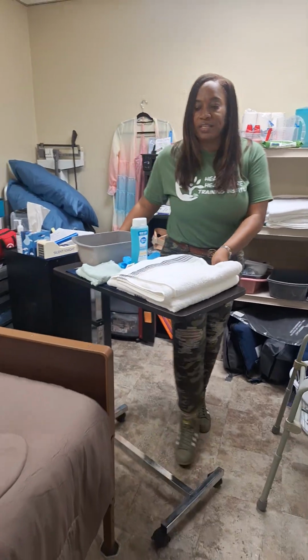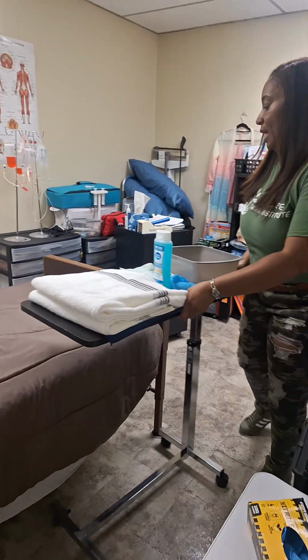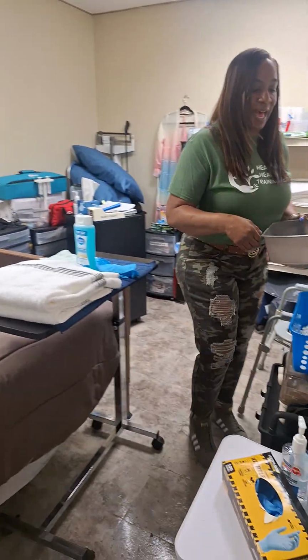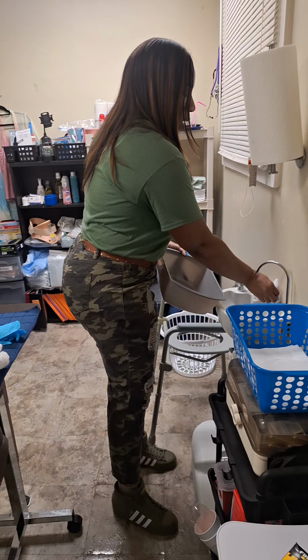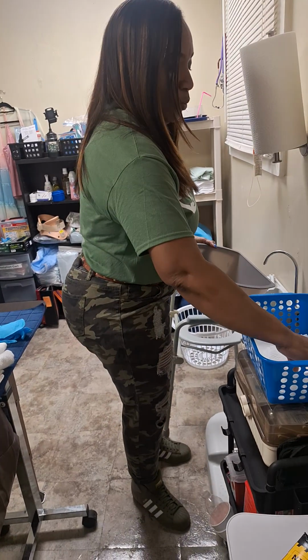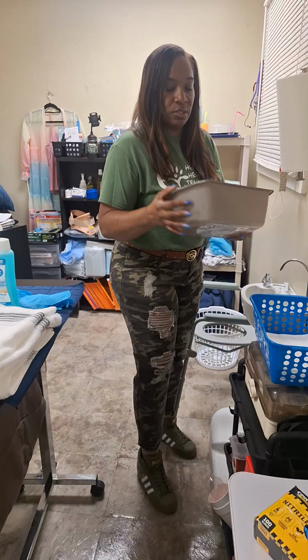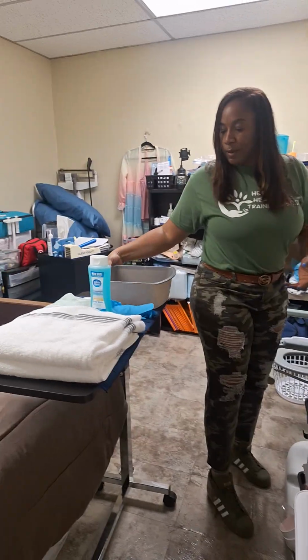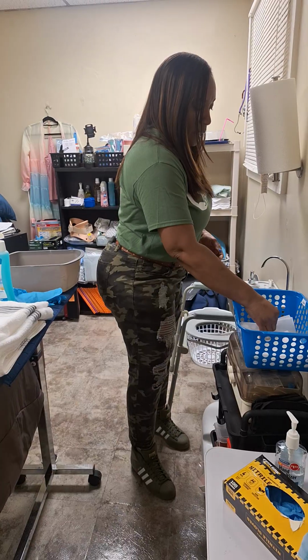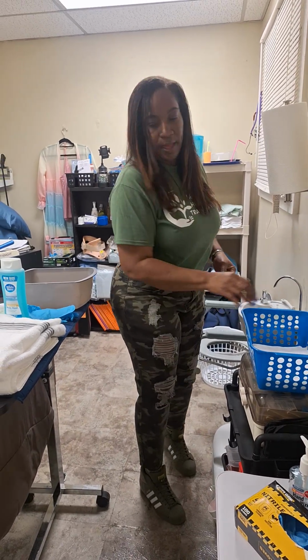So I'm going to bring this over here towards the sink. And I'm going to grab my paper towel to turn on the water. I'm going to fill my water to the 2 line. You don't need a lot of water. You just need it to be to the 2 line. Just enough water to clean it. I'm going to make sure it's the right temperature. Once I've got my water, I'm going to set it down. I'm going to grab another paper towel to turn off the water and discard that.